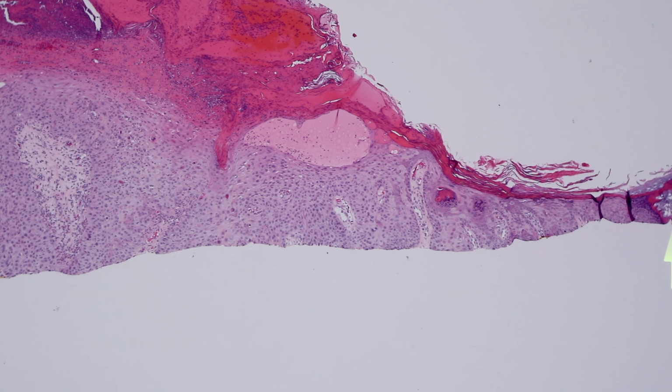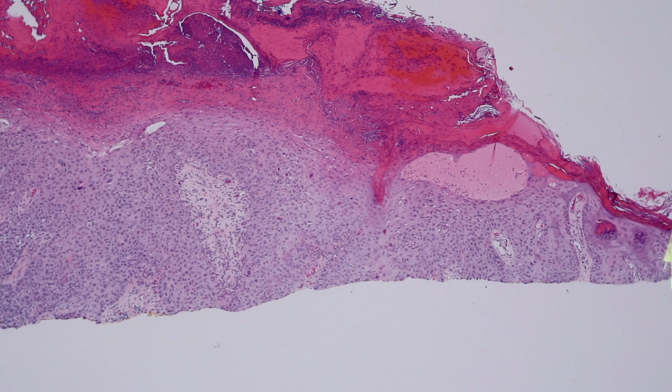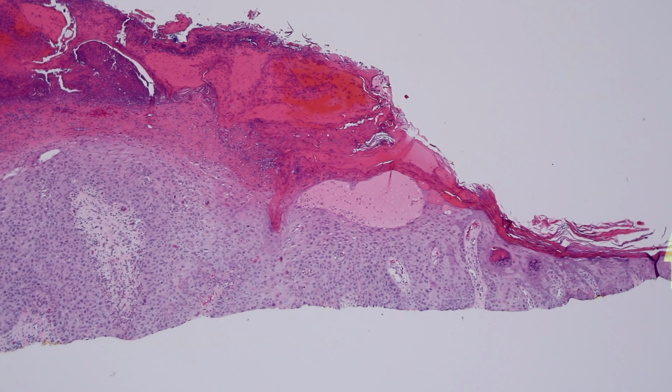Most of our dermatology colleagues don't really care in our practice. I have a couple colleagues that do, but most of them are like, it doesn't matter whether you tell me positive or not, I'm going to end up treating this lesion the same way regardless of what you say there. So you have to do what works with your practice and your colleagues, but in our community, we've basically stopped doing that for most of our colleagues, and we have good data that we've published in the Archives of Pathology that actually supports that practice. But when it is broadly transected like this, and I'm not sure if there's invasion, I'll say squamous cell carcinoma, comma, at least in situ.